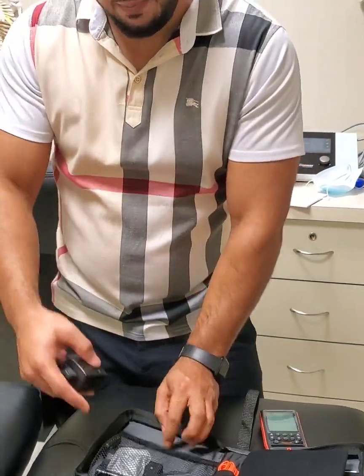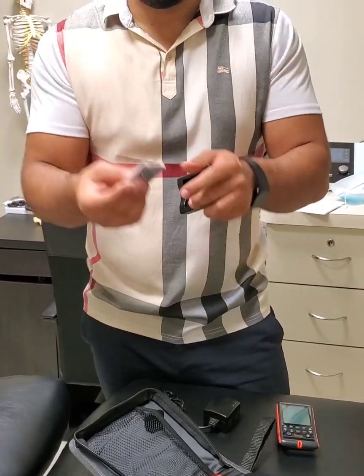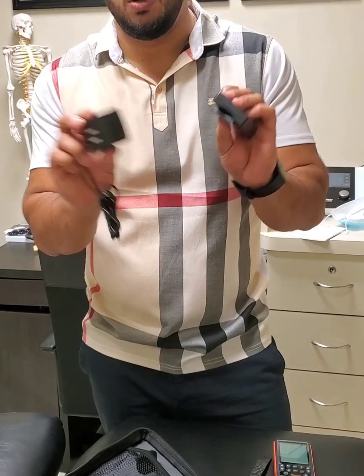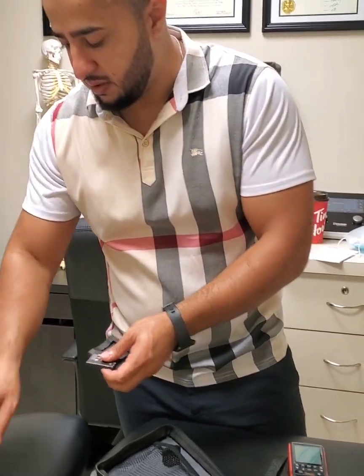It comes with a rechargeable battery. You take the battery, plug it into here, and then plug that into the wall. That is the rechargeable battery.